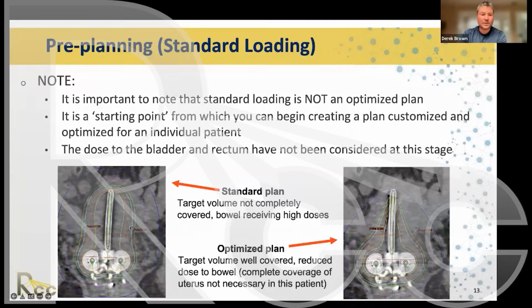In some of our patients, we don't change this at all because it's perfect. It's good enough. In some of our patients, we change it a lot. Why? Because patients have significantly different anatomies.